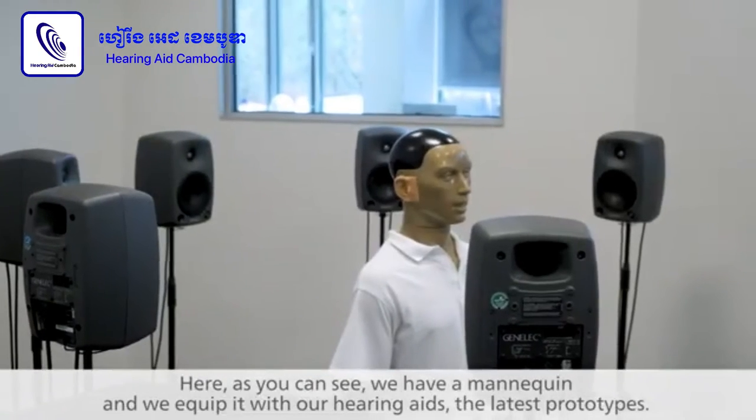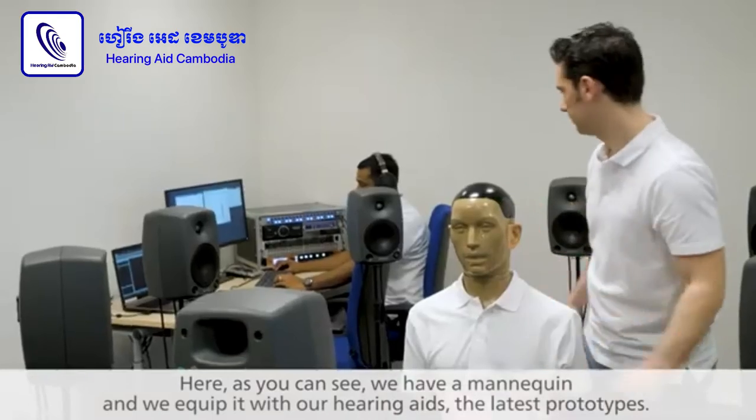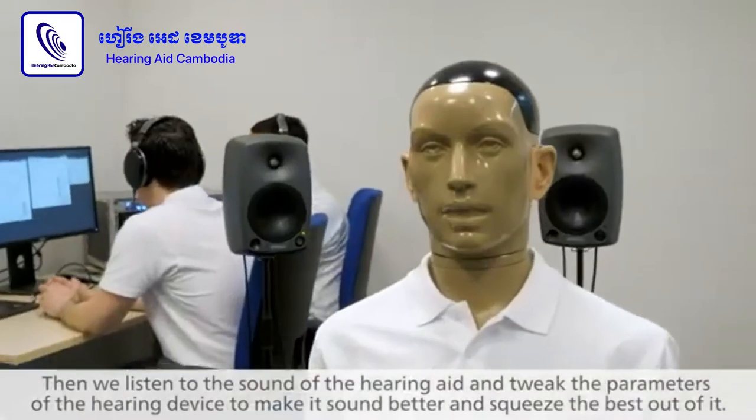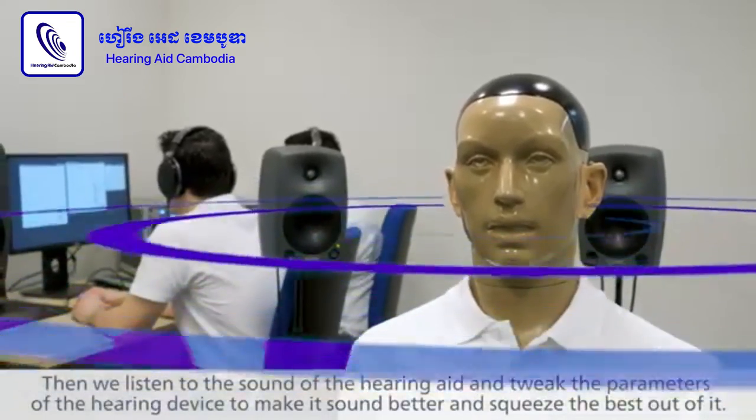In this lab, as you can see, we have a mannequin and on this one we mount our hearing aids — the latest prototype. We'll be listening to the sound of the hearing aid and then tweaking the parameters of the hearing aid to make it sound better and squeeze the best out of it.